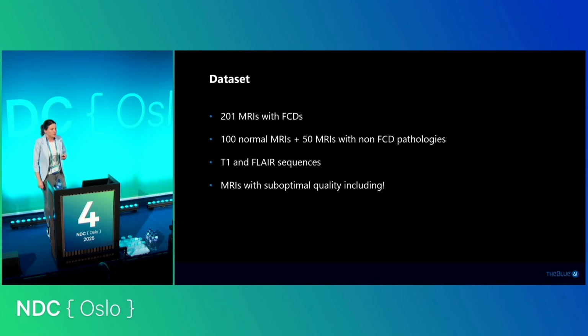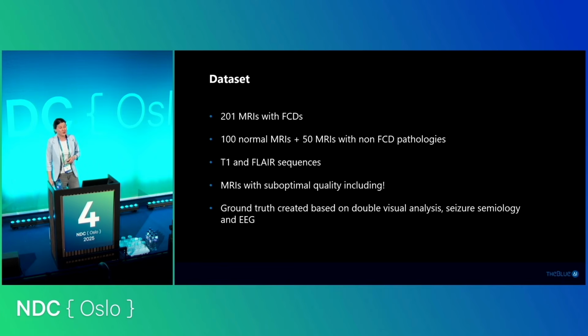But as I said, we wanted to be as close as possible to reality, so we've also taken all of the MRIs that were of suboptimal quality, meaning someone moved a little bit, or something happened to the scanner. I mean, things happen. So we also wanted those included in our data set. And we also wanted to be extremely sure that we teach the model based on really good data, meaning that we have had it analyzed by a few epileptologists. We have analyzed the type of seizures that people were having, as well as the EEG data, so these electrodes that are measuring your brain activity.